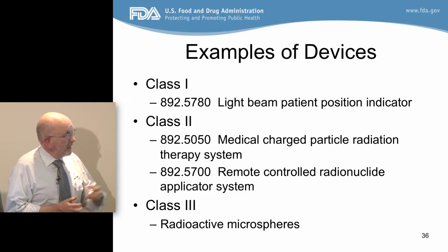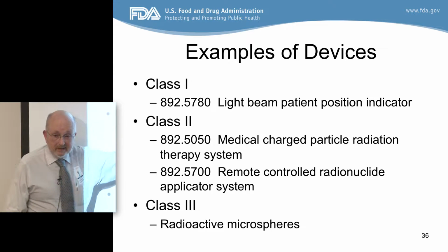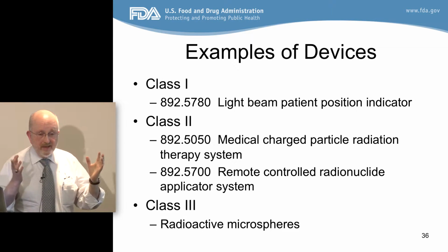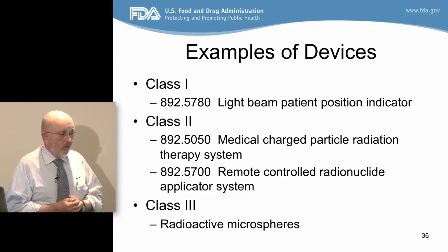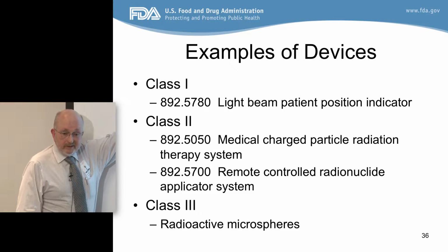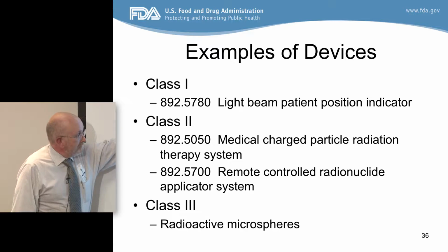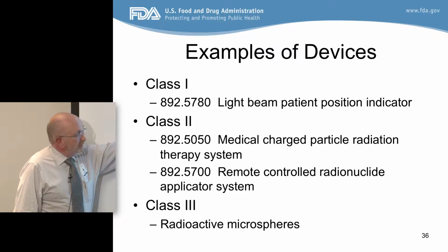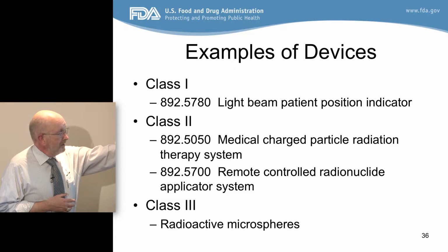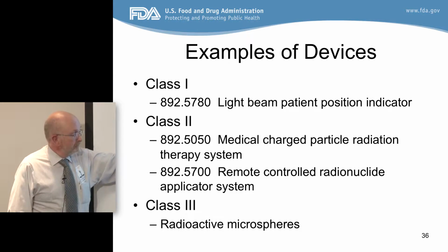of these devices. But if you go off and innovate with one of these, and you make it computer controlled, or you have it being talked to or talking to a treatment planning device, it doesn't stay at class 1. It actually can go to class 2. It can end up being a subpart underneath linear accelerators. Class 2, this is the 510K class.